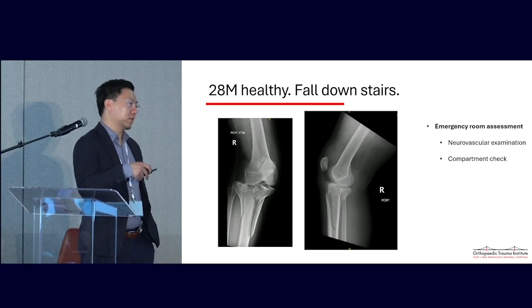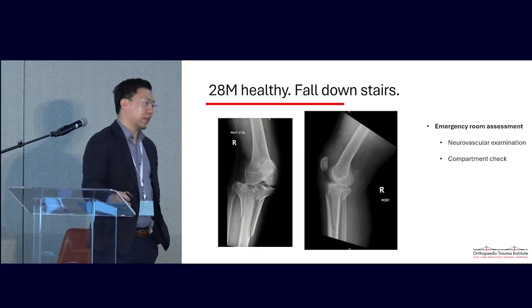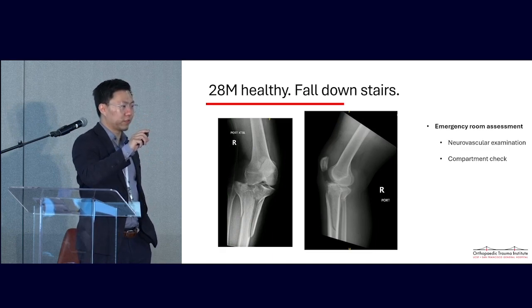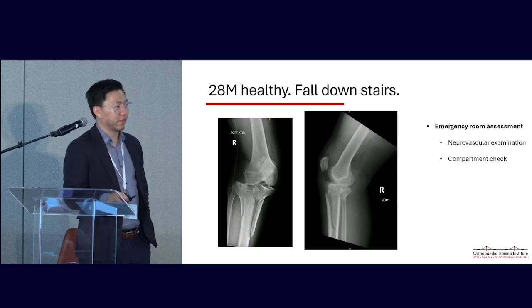Oh, you're talking about instead of a suprapatellar nail versus an infrapatellar? I was just trying to say, are you glad you used the plate, or could you have considered just doing the nail without the plate? I initially considered just nailing it, but after looking through the CT and measuring some of the distances, I got a little bit fearful about not having enough fixation proximally. And then also it just helped. You were glad even after you did it that you put the plate on? Yeah. Okay, that's all I was asking.